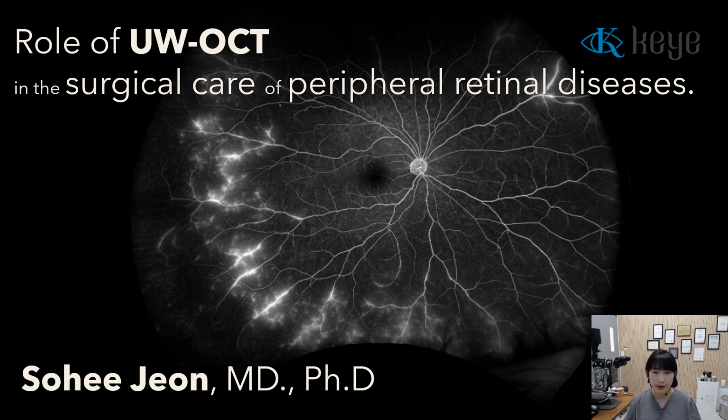I am so glad that I can share my experiences on the ultrawide OCT in the surgical care of peripheral retinal diseases. My name is Jeon from South Korea.